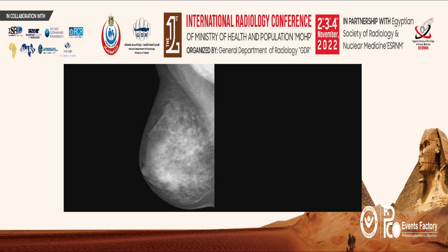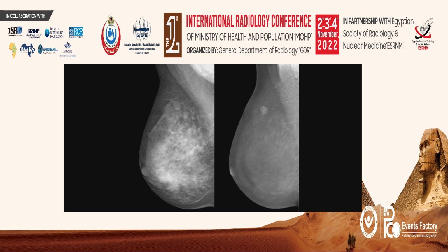Here's an early case from my first study, and what you're looking at is the standard mammogram, and you can see that the tissue is very dense. What you don't know is that the patient came in with a palpable abnormality that was suspicious on ultrasound. So we enrolled her in our study and did a contrast mammogram, and the contrast mammogram is this. So very hard to see the cancer on the left-hand image, but extremely easy on the right-hand.